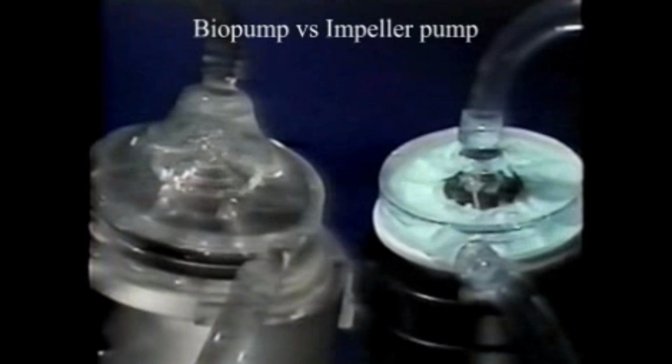This is basically a comparison between the biopump and the impeller pump. The biopump will take the air bubbles into the center and not allow the air to go out. The impeller pump can even lead to some kind of hemolysis, and that is the reason for preferring the biopump. The biopump basically has the center of the vortex property. See, the air bubbles are there. They get trapped in the center and do not go to the periphery, which will not be the case with the impeller pump.